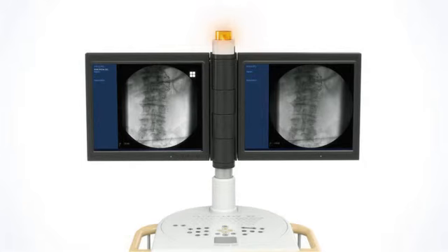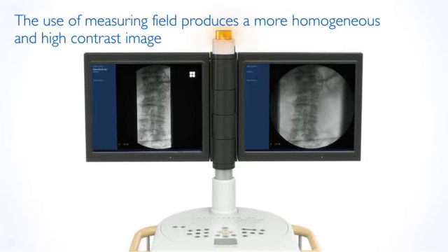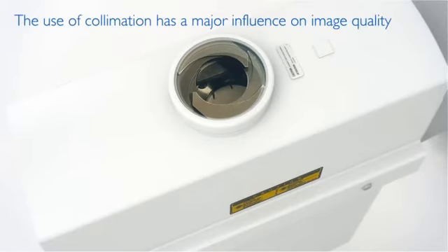The use of the mobile C-arm's measuring field produces a more homogeneous and high-contrast image, while the use of collimation has a major influence on image quality and aids in the reduction of radiation exposure to both patients and staff.